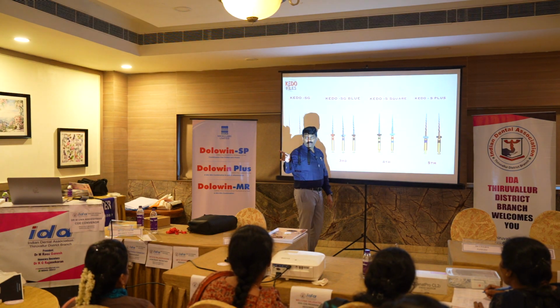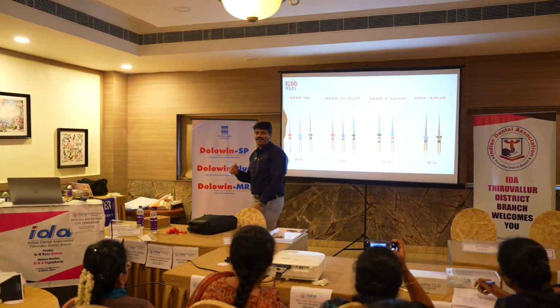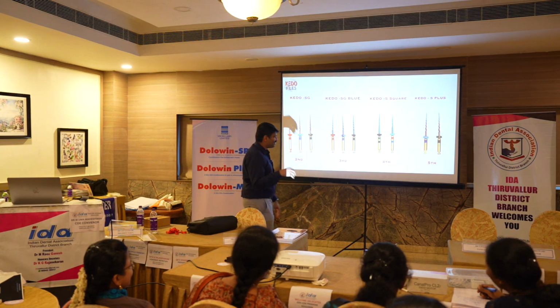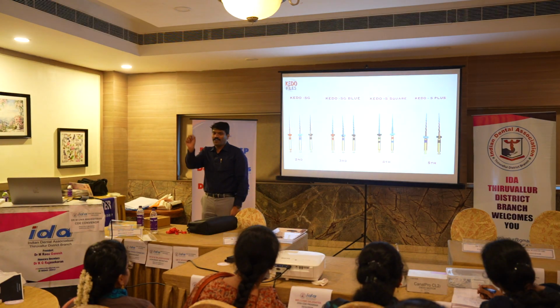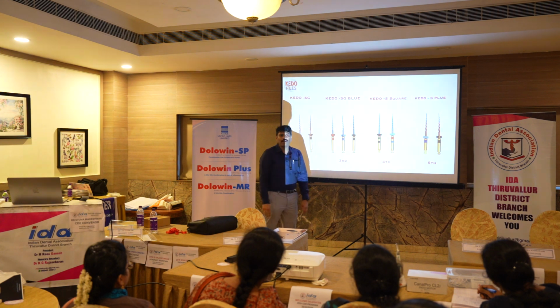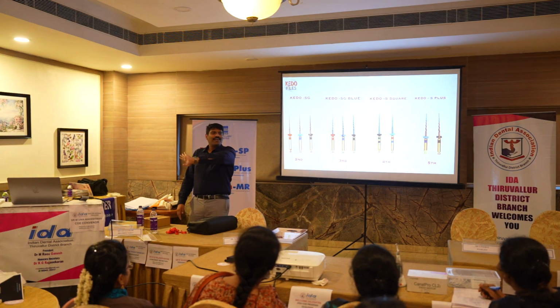Now any endodontist here? Endodontist. Okay. Usually I don't talk when there is an endodontist because of the ISO standardization of manufacturing rotary files, which says 15, 20, 25, 30, 35 should be the tip diameter. I have bypassed and kept 0.28. Right or wrong? It is right because it has been there for a long time. Anybody else?